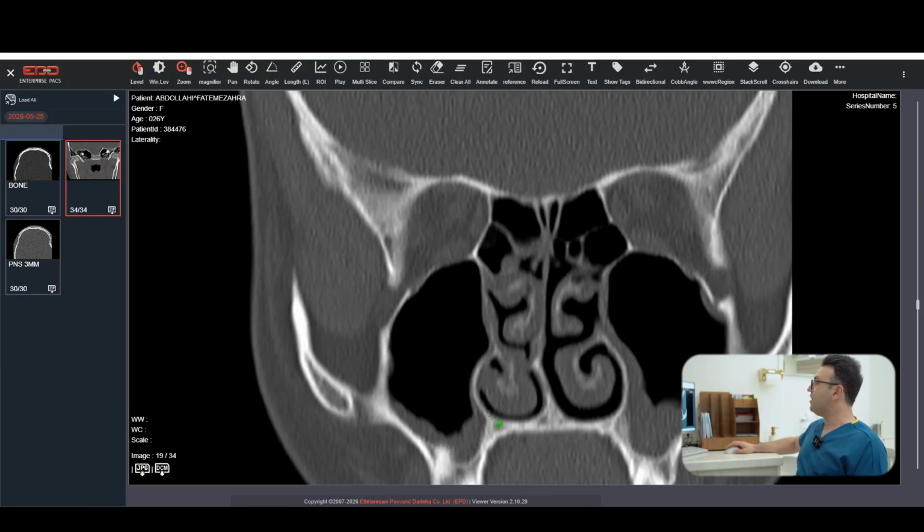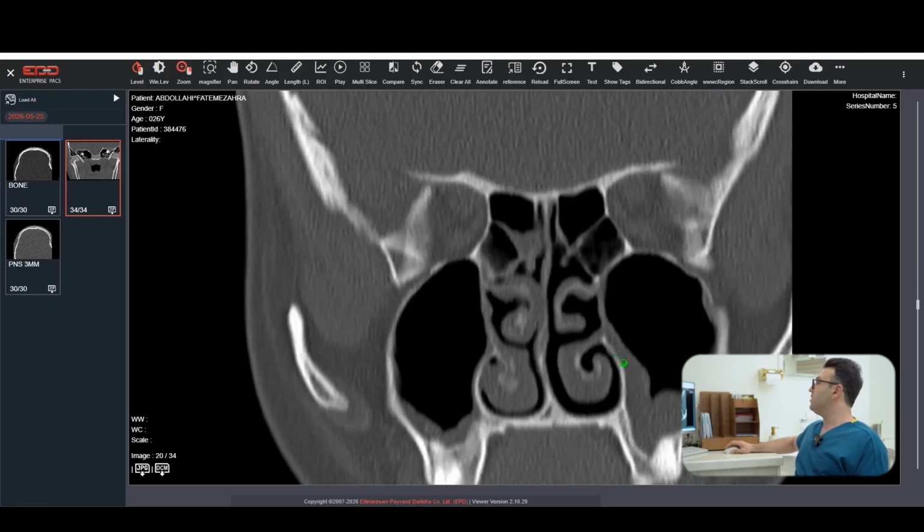So that is actually the applied anatomy. It means that you should be very careful. You should know what you want to see on the CT scans. And after that, it is easy to evaluate and assess your patient. Without knowing what you are seeking, actually you are wasting your time. Just to check that this is the palate, that is the septal deviation, or I see the turbinates, that is not enough. You should complete the problem list of the patient. After that, you can have a very good surgery, and you are going to be very successful in that case.